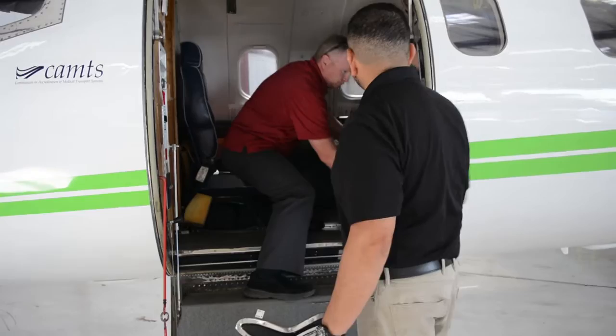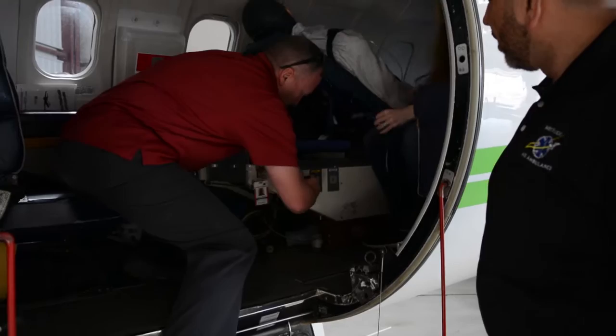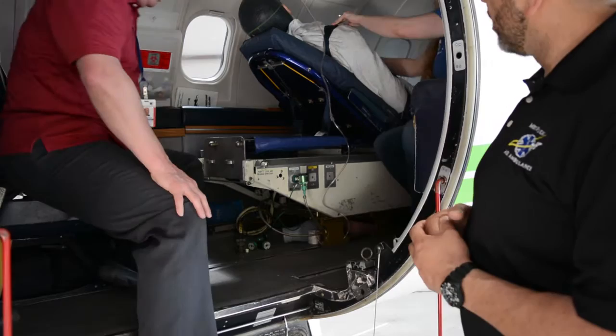We're going to bring the patient to the upright position as soon as possible. And then we're going to make sure we have our O2 going and get that patient hooked up. And again, we can start getting our monitors into place and making sure that the patient is comfortable and belted in correctly for the flight.